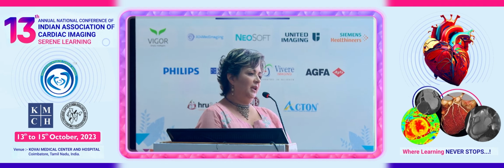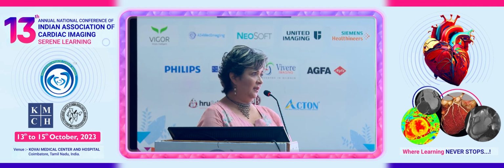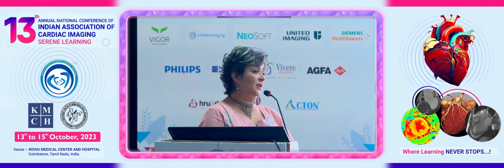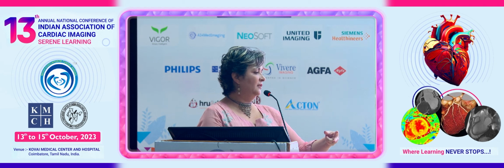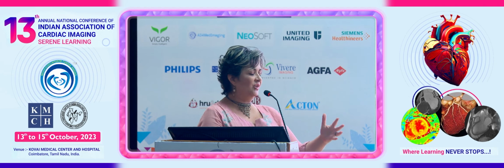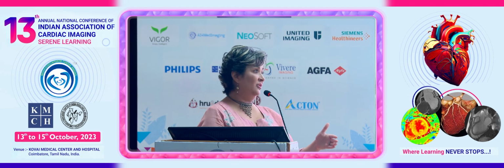So if you are confident with your mapping values, yes, it seems that the native T1 is useful to follow up these patients and their treatment. LGE could be tricky because of this histological component, because it could change into fibrosis, and then the extracellular volume will change, and the distribution of LGE will change as well. So only the native T1 is the one that is reliable for that.